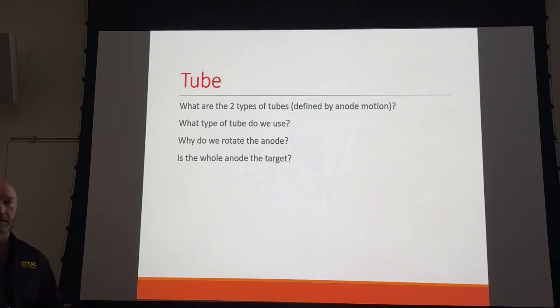And the other is the transfer of energy through space, and we talked about that, not really beginning with this, but earlier in the semester, when we call transfer of energy through space, radiation. All right, so we get thermal radiation. So we use all 3 of those. And in the rotation of the anode, it helps with that conduction.